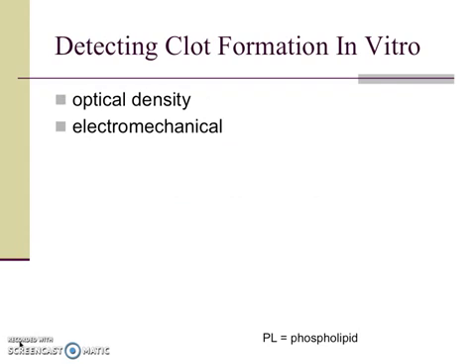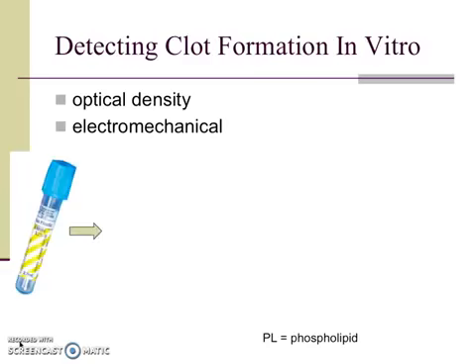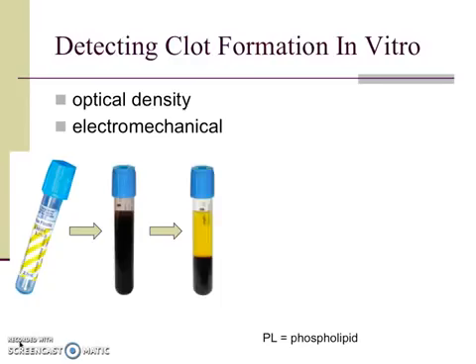This slide illustrates how the patient's blood specimen is collected and processed to measure the PTT and PT. The patient's blood is first drawn into the blue top tube, which contains sodium citrate, so that the blood will remain in liquid form for analysis. Once the tube arrives in the lab, it is centrifuged to separate out the red cell, white cell and platelet, and plasma layers from one another. The automated analyzer then aspirates a portion of the patient's straw yellow plasma layer to analyze the PTT and PT.